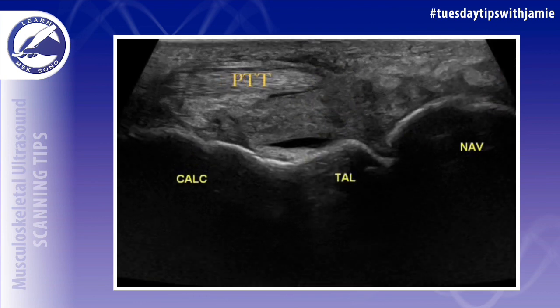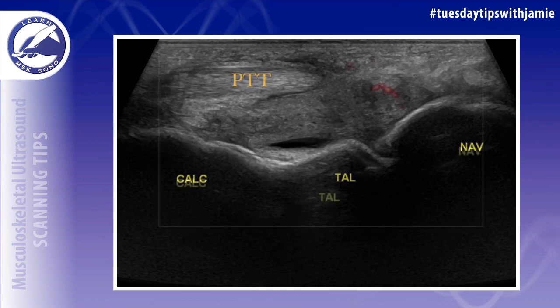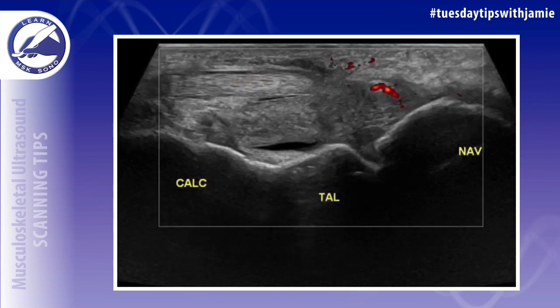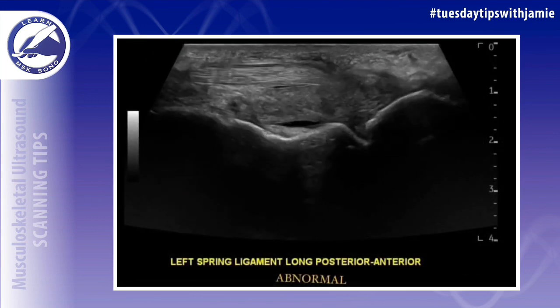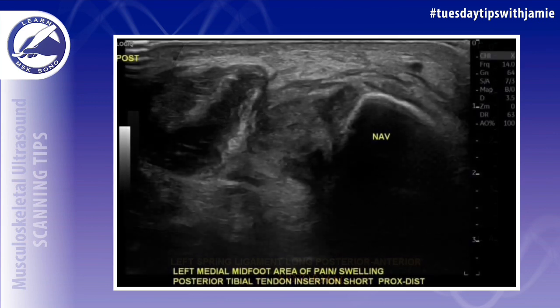This ligament is commonly affected in patients with posterior tibial tendon dysfunction. It should be evaluated for any hypoechoic thickening, disruption of the ligament fibers, hyperemia when using power Doppler, or laxity of the ligament during stress maneuvers.